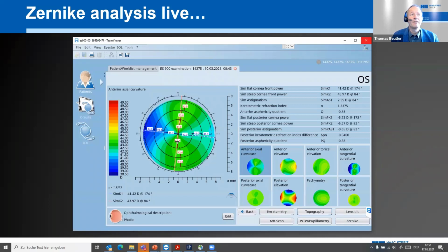Still for the IOL calculation, the power, I would most of the time go for the keratometry and the axis, depending on where you're going to go. If you have big discrepancies, you might anyway just opt for a spherical implant, because then there might be other reasons why we have such big differences. That's usually due to big differences or big asymmetries in the astigmatism. And then it might not be the best option to go for a premium implant. But keratometry itself is still quite stable and independent of the measurement quality itself.